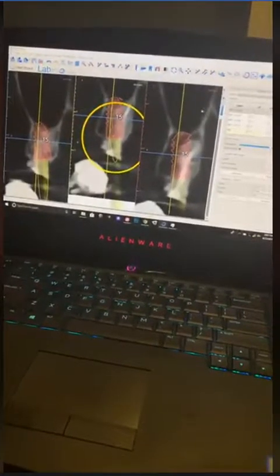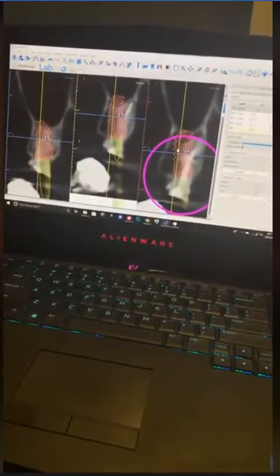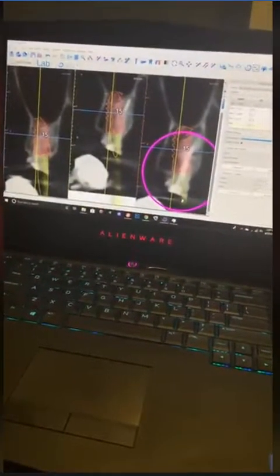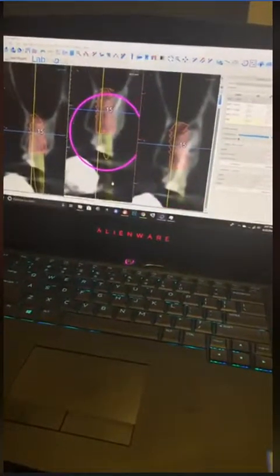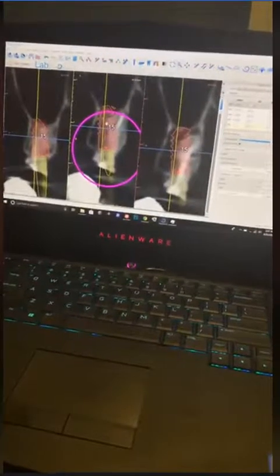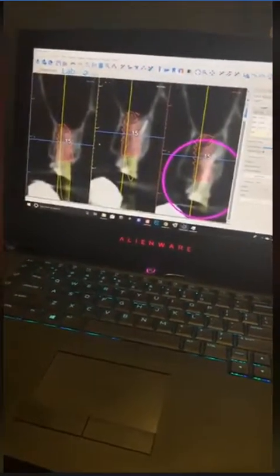I actually wanted to grab on that cortical level over here so I have good stability, because again, in the tuberosity area, close to the tuberosity of the posterior maxilla, you have very soft bone, so it's probably best to try to grab on something so you have good stability of the implant on an immediate case.